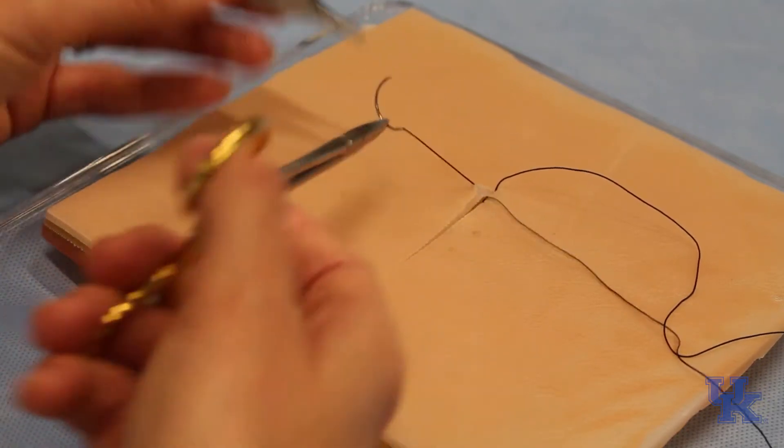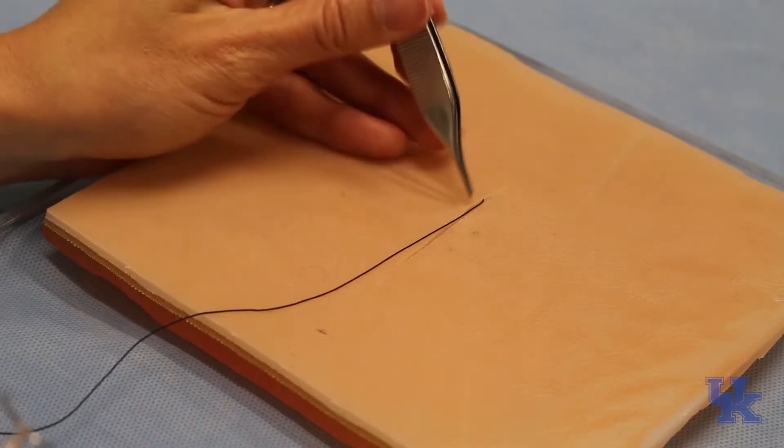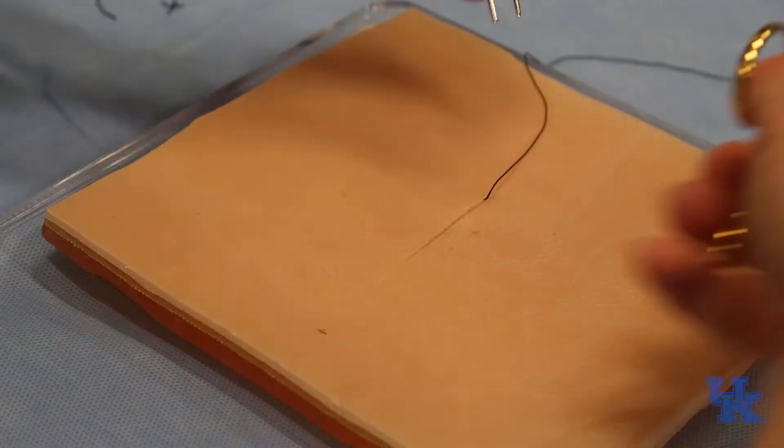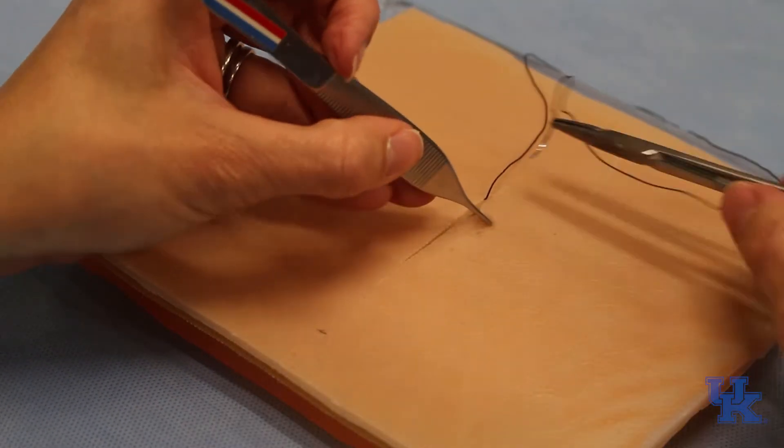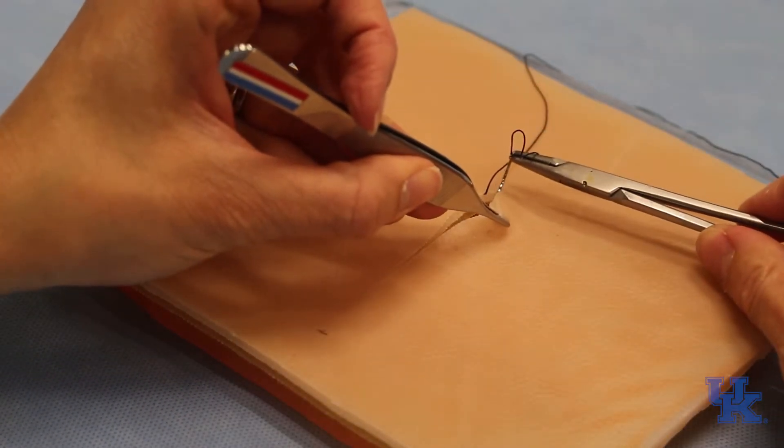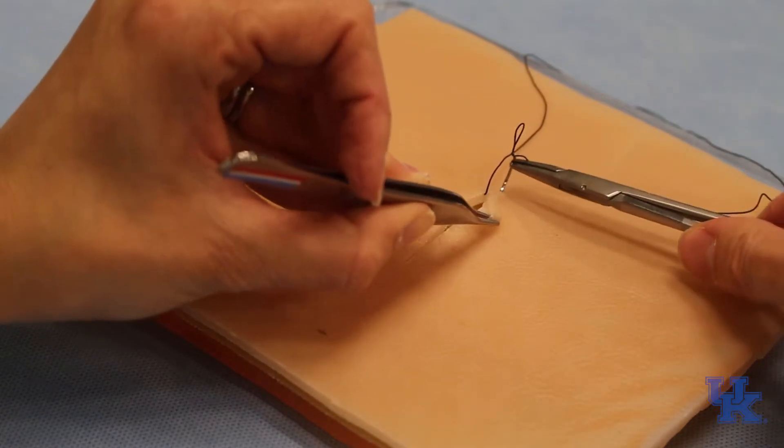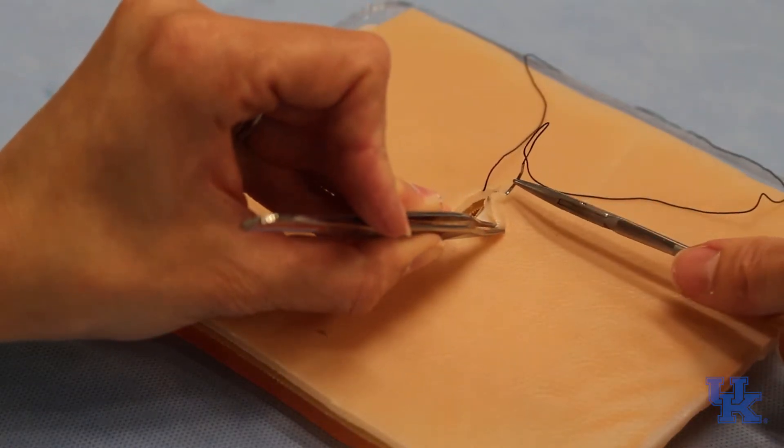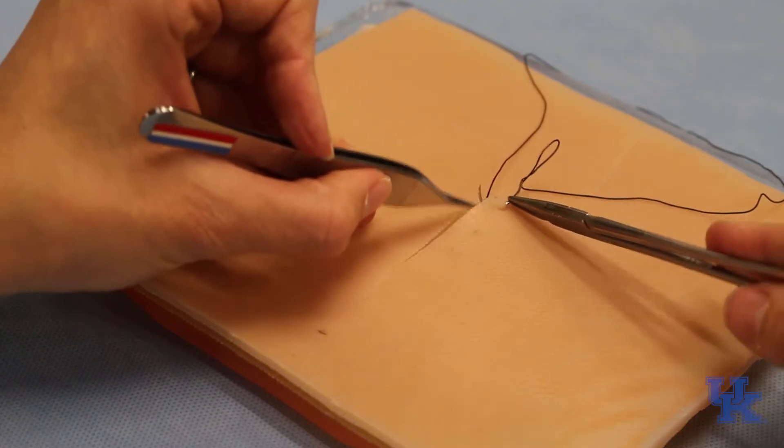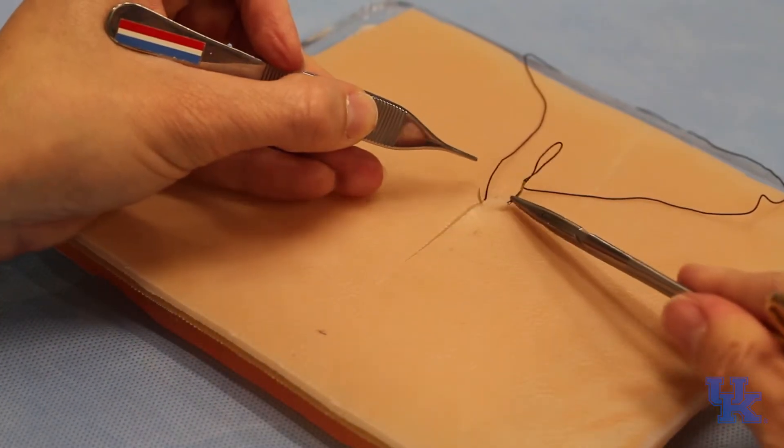Now our suture will be coming out at the level of the subcuticular plane. As we run this, you want to go back in at that same level, and you want to try to go in 90 degrees, rotate back, grab some tissue. You see the tip was coming out. The tip is going to come out further down, and so you're in that dermal area.